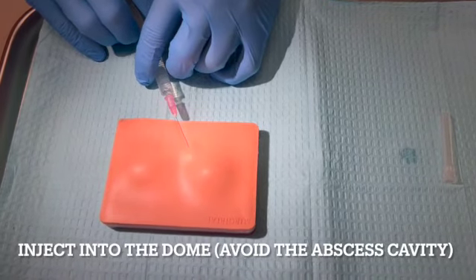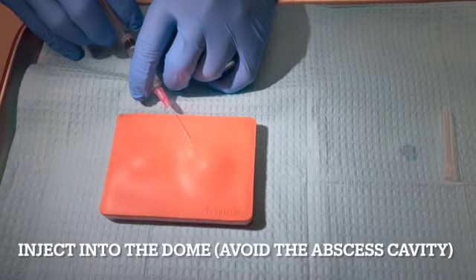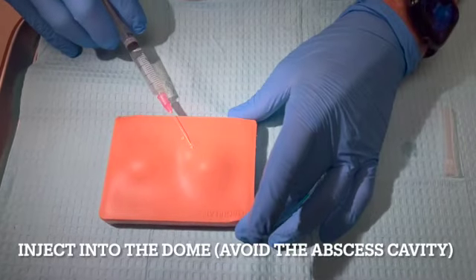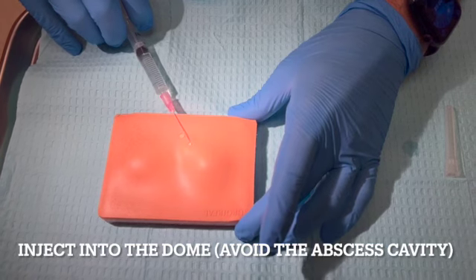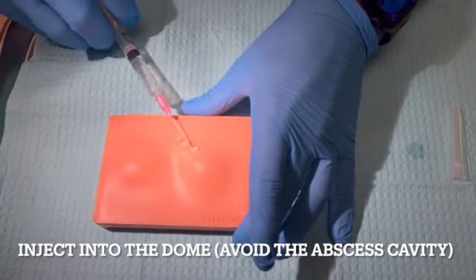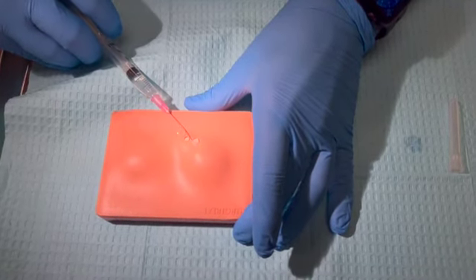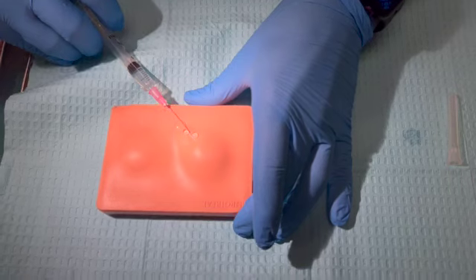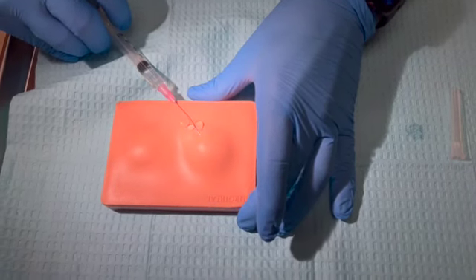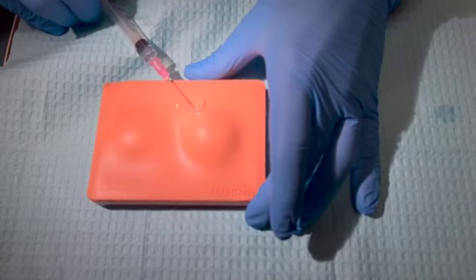Come along, we want to be conscious to inject the medication within the dome of the abscess, keeping very superficial. Again, this is where our scalpel will be inserting, and we want to have the area as numb as we can. Going too deep within the cavity can result in a premature rupture of the abscess that can be downward into surrounding tissue or outward toward the provider.